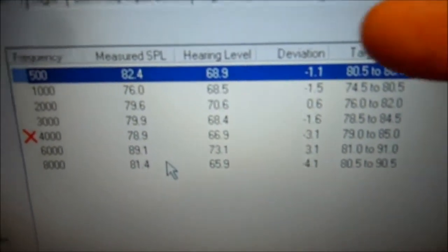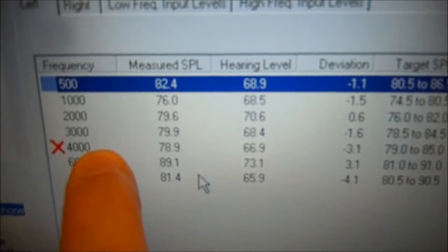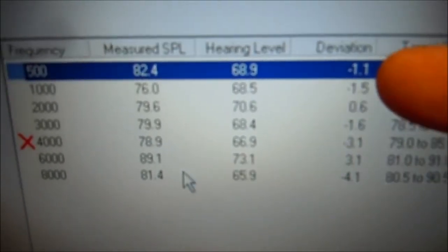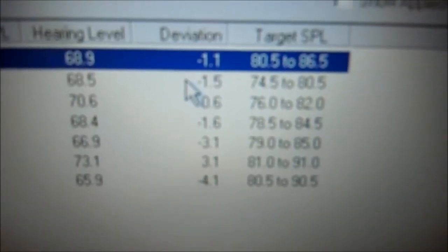Now what I like to do is look at the deviations. Even though the 4,000 had failed its deviation, I like to try to get all these to near zero. So we're going to go back to 500. Since that is a negative, we're going to go up. If it's positive, we go down.